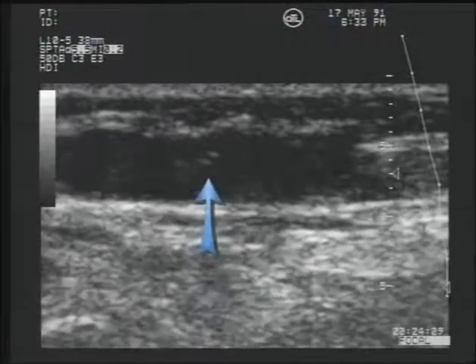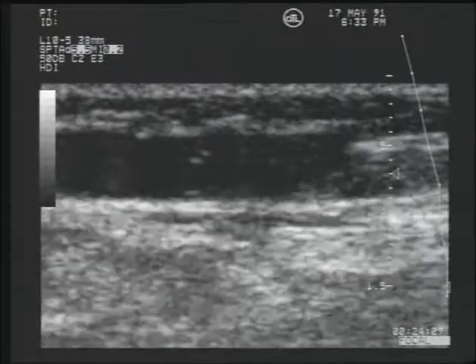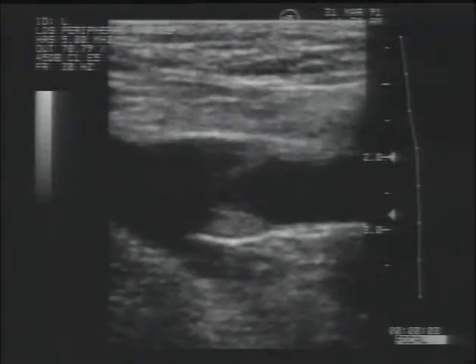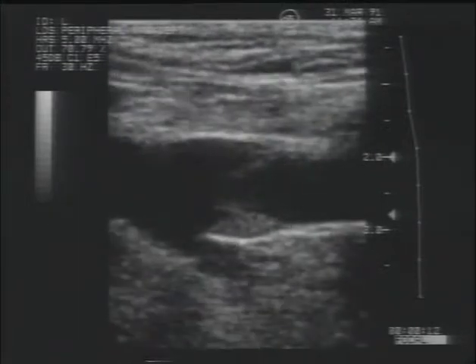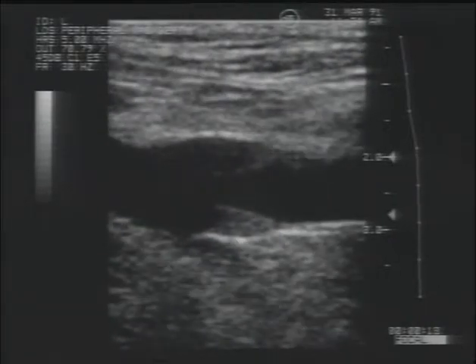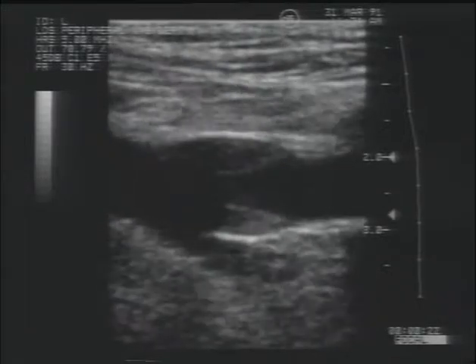Of course, damaged valves may be thickened and may not function as described above. This can make differentiation between thrombosis and valve leaflets more difficult. Another potential for error when visualizing valves is that blood can become trapped in the valve cusp and create the appearance of thrombus behind the leaflets. The vein should then be compressed to see if compression will evacuate the blood from behind the cusps.